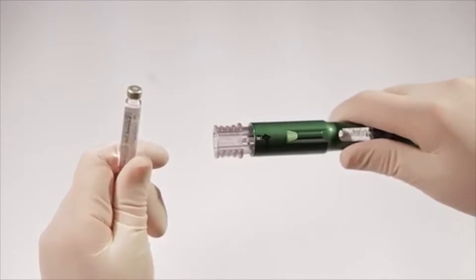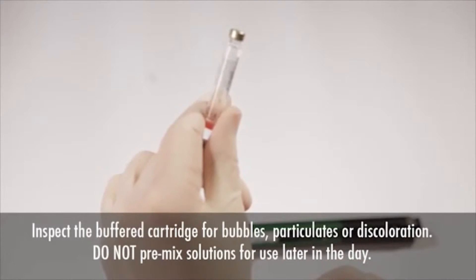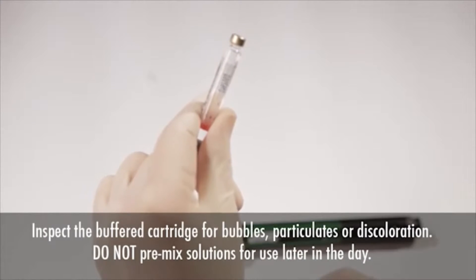When the 1.8-milliliter cartridge is ready to be used, be sure to inspect it in order to rule out bubbles, particulates, or discoloration. Do not pre-mix solutions early in the day for later use.